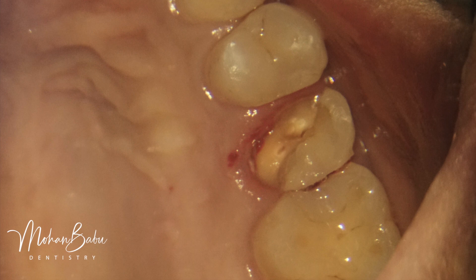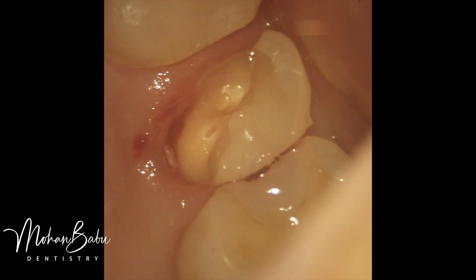Only the buccal aspect of the tooth was remaining. The actual treatment plan was to extract the tooth and place an implant, but this patient — himself a dentist — did not want an extraction and wanted to save the tooth by any means. So we planned for a pre-endo buildup, root canal treatment with post and core, crown lengthening, and then a full crown.